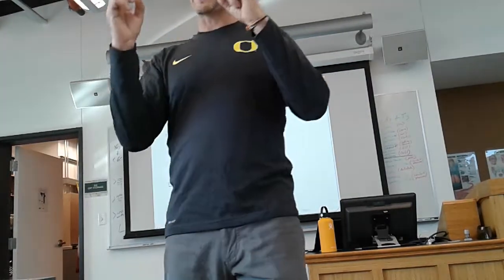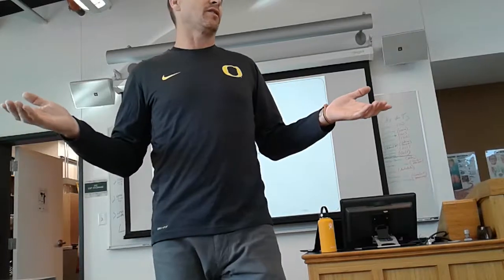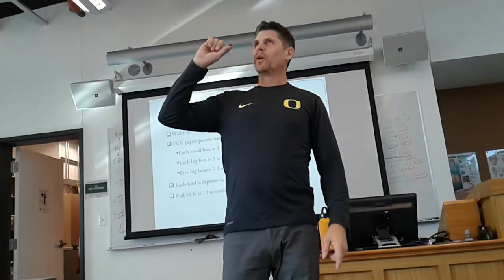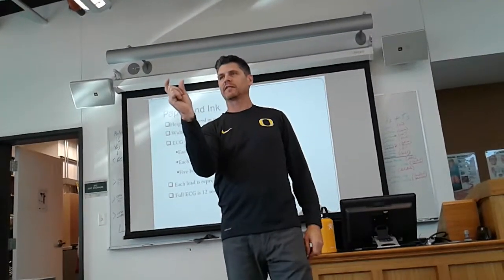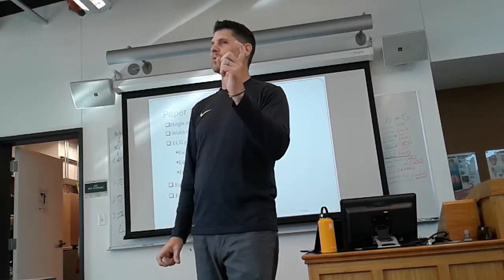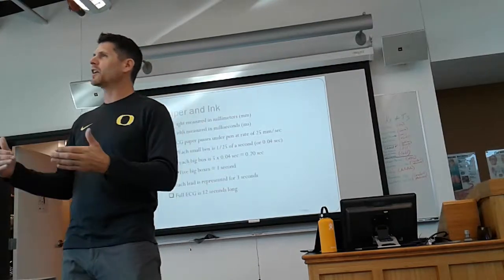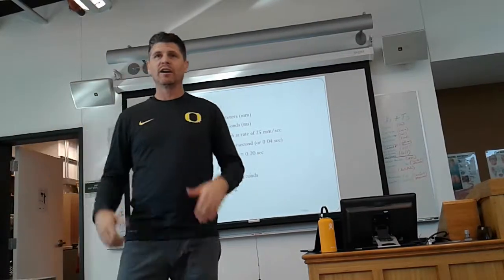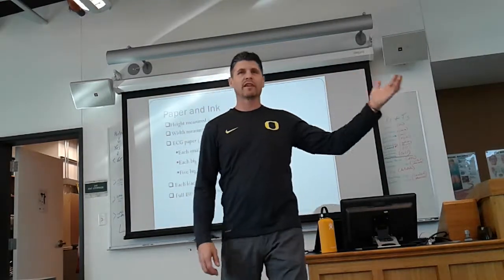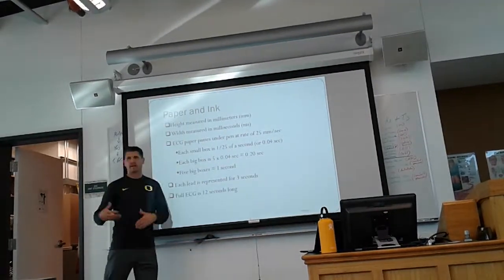Sometimes I want you to care about the actual measurement of time because I want to see that you're doing it correctly, and other times I just want you to know that it's within that range. Does that make sense? So 0.12 would equate to how many little boxes? And 0.2 would equate to how many little boxes? Five, or one big box. So when you're doing a check on the PR interval and you don't care what the actual time is, you just make sure it's between 3 to 5 little boxes, and then make sure it's the same for all of them. So sometimes we care about time, and sometimes we do not.